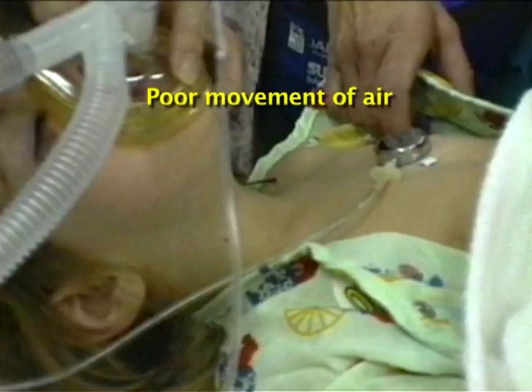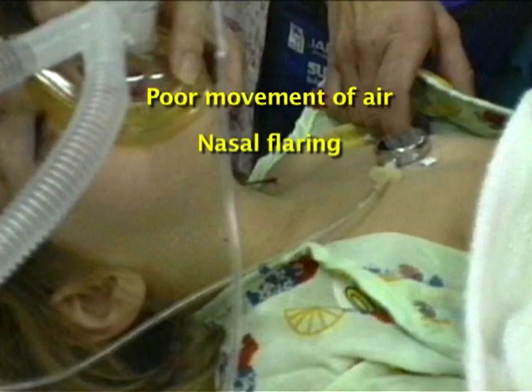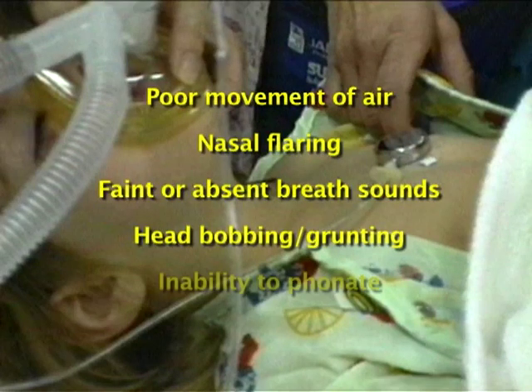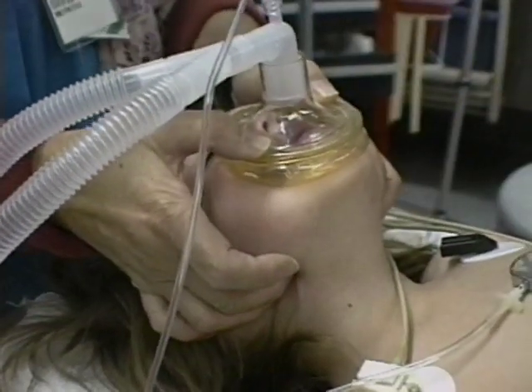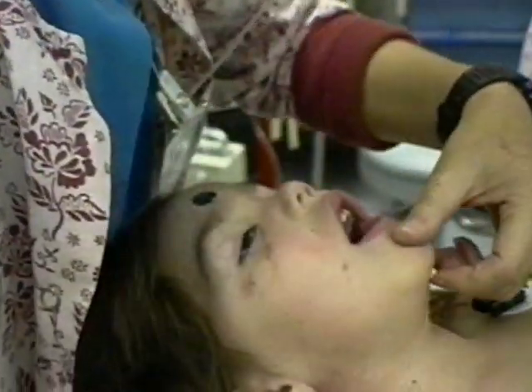Other signs of airway obstruction can include poor movement of air in and out of the mouth and nose, nasal flaring, faint or absent breath sounds, head bobbing or grunting, and the inability of the awake patient to phonate. The anesthesia provider opens the airway by pulling up on the jaw, then inserts an oral airway.